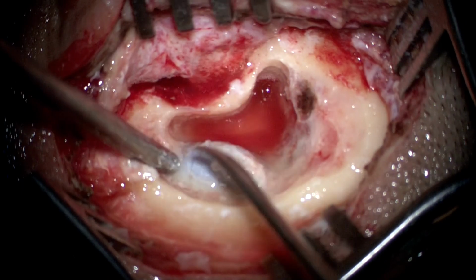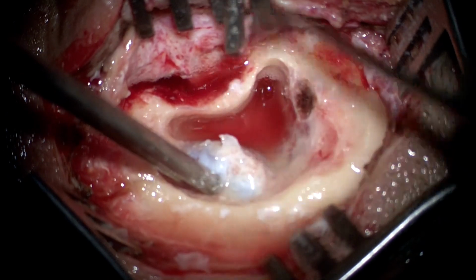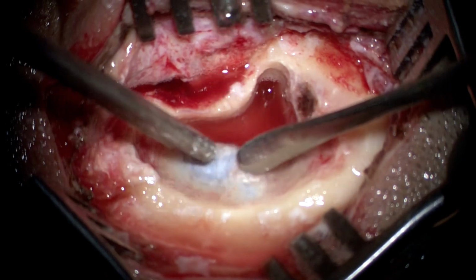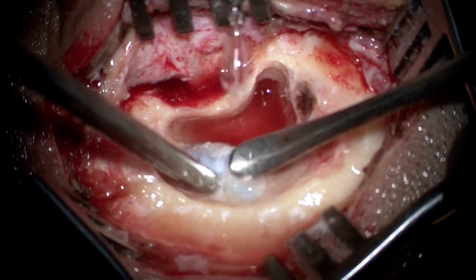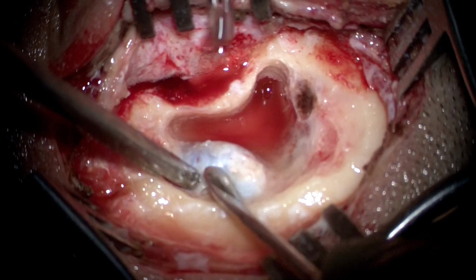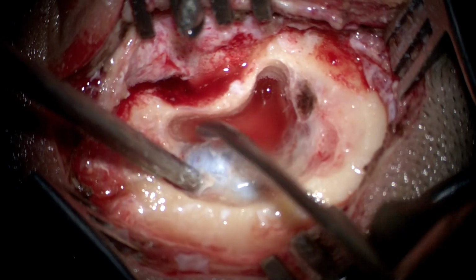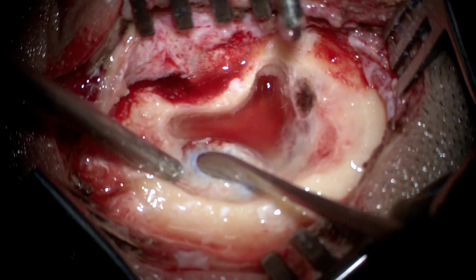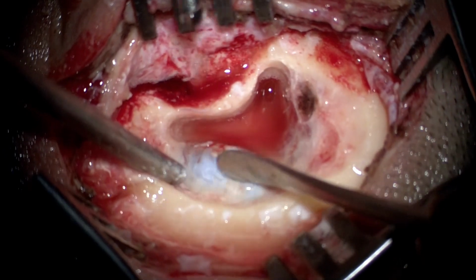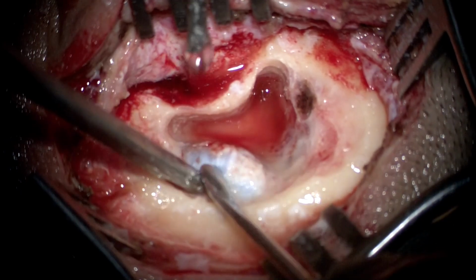We strictly advise against the use of micro ear instruments or micro flap elevators for this step, because they are very fine and sharp and they can easily puncture the sigmoid sinus dura, thus causing hemorrhage. So it is best to resort to broad and blunt elevators, the kind we normally use in septoplasties or in the periosteal flap elevation in ear surgery.